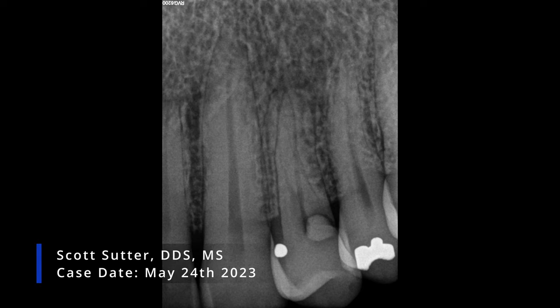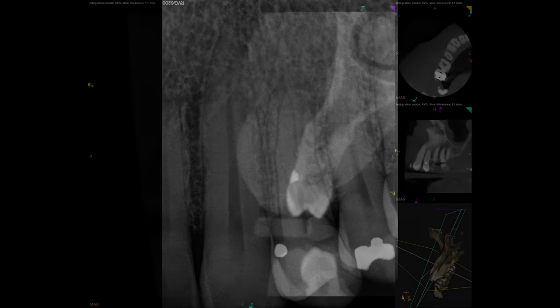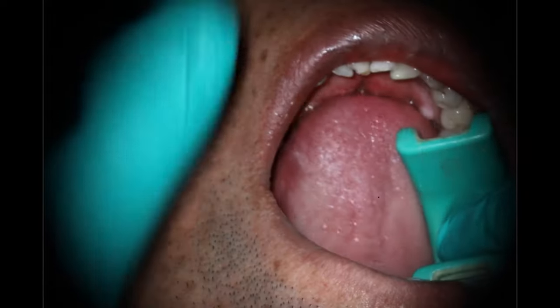Hello everyone, we have a new one for you today. I was referred to this case for teeth 11, 12, and 13. Couldn't really see anything super obvious on the PA. When you look at the cone beam, same thing — not really obvious there. When you get inside the mouth, you can see the drainage sinus track. I ended up doing some testing: 11 and 13 were both totally fine. 12, however, is necrotic. It does appear that the Class 5 was the culprit, that it was close enough to go in and take that tooth out.